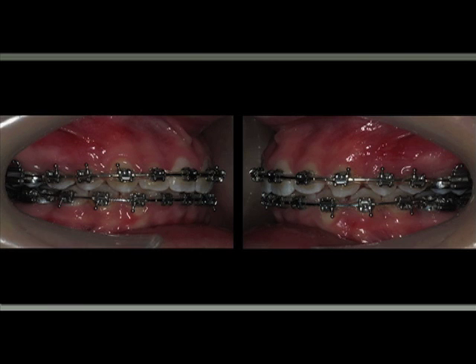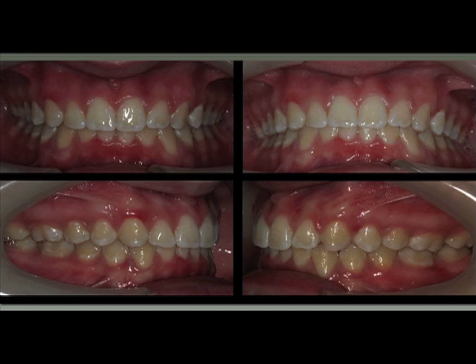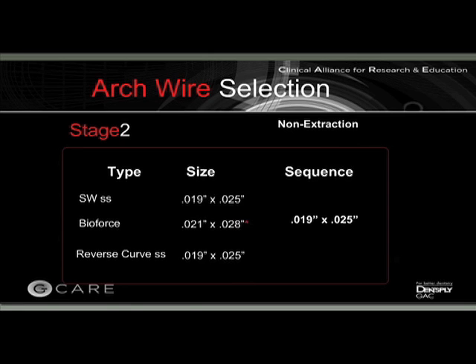And then it's more parallel, and then more parallel. Then we start closing the spaces, and we are back to where we should be, basically with the upper and the lower occlusal planes parallel. And then we finish the case. You can see here the frontal view too, with the arches coordinated and the occlusal plane parallel.